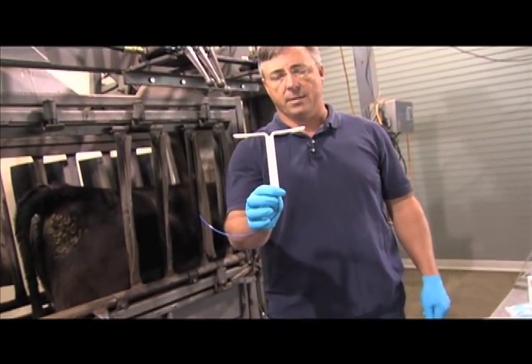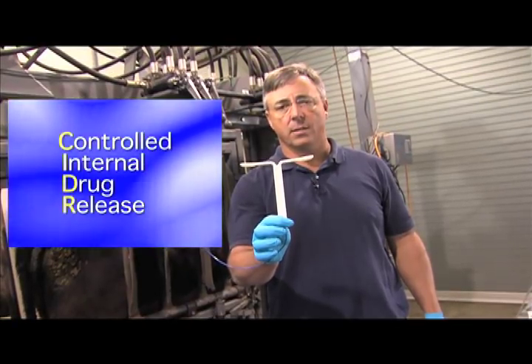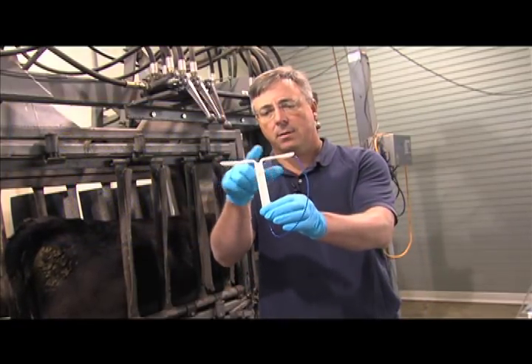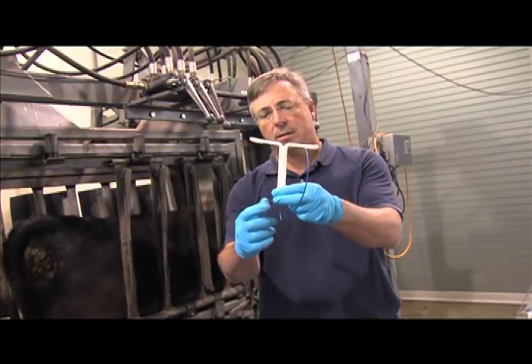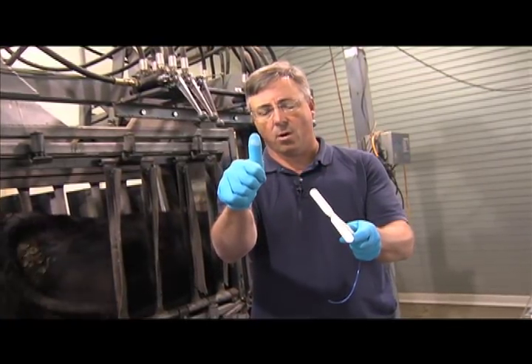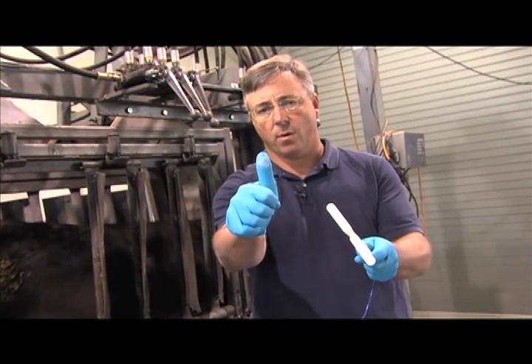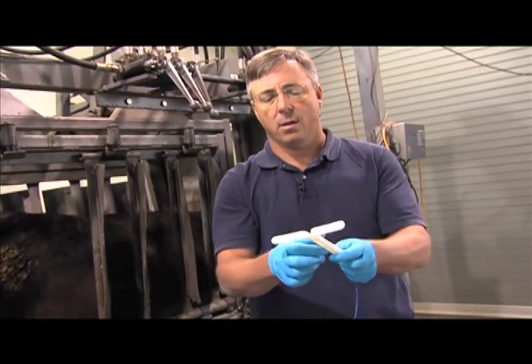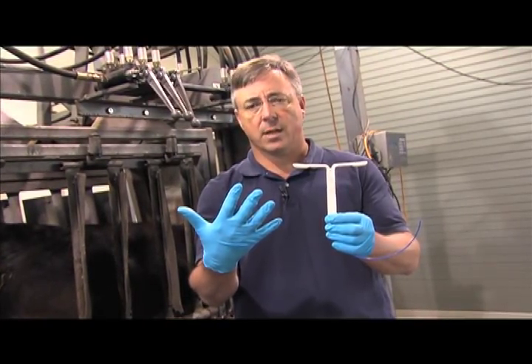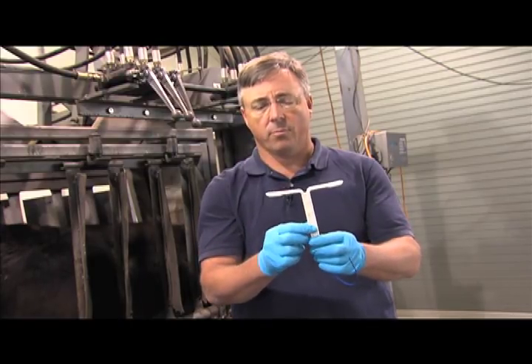Next you'll take the cedar device. Cedar stands for Controlled Internal Drug Release, CIDR, and the cedar device is a T-shaped plastic device that's coated in the hormone progesterone. As I rub my finger over the cedar device, some of the hormone is able to be rubbed off the plastic onto my latex glove. Whenever you're handling these devices, it's very important that you wear some sort of protective coating on your hands because the hormone will be rubbed from the device.